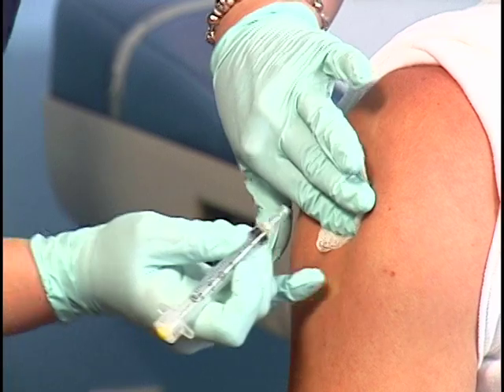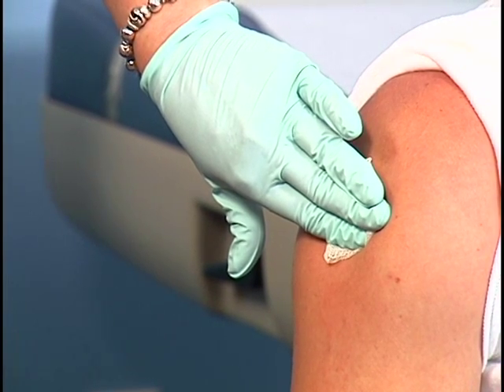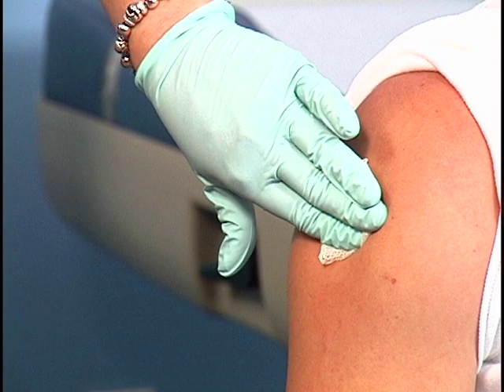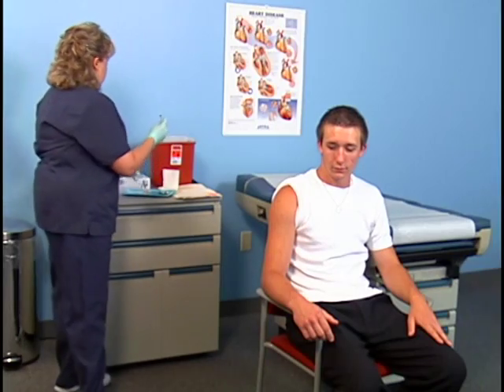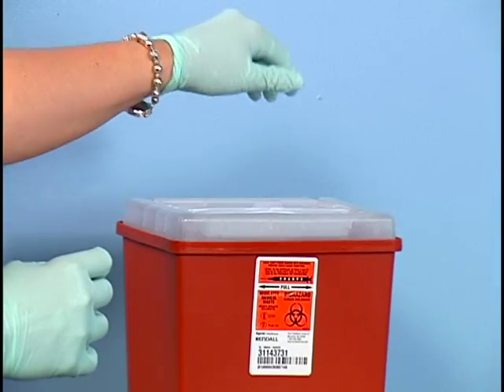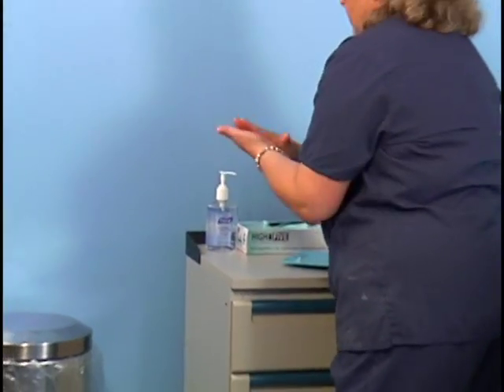Place a gauze pad over the injection site. Apply gentle pressure to the injection site with the gauze pad. Gentle pressure helps distribute the medication so that it is completely absorbed by the muscle tissue. Avoid vigorous massaging because it could damage underlying tissue. Properly dispose of the needle and syringe in a biohazard sharps container. Remove your gloves and sanitize your hands.